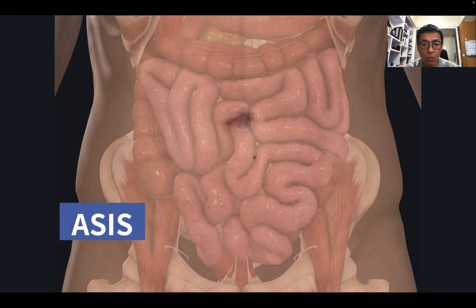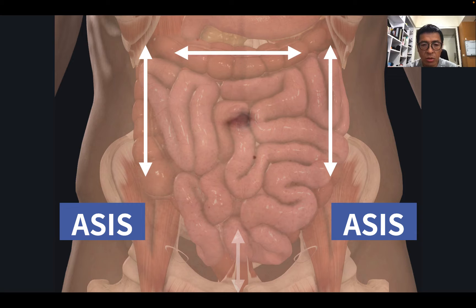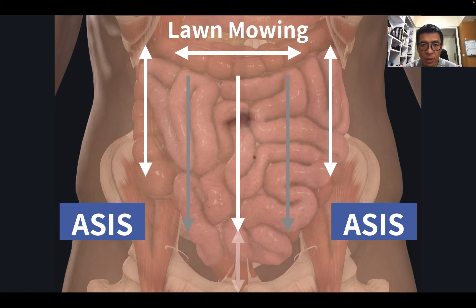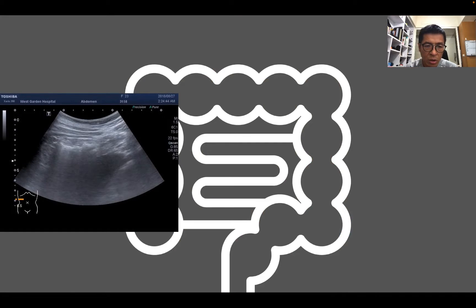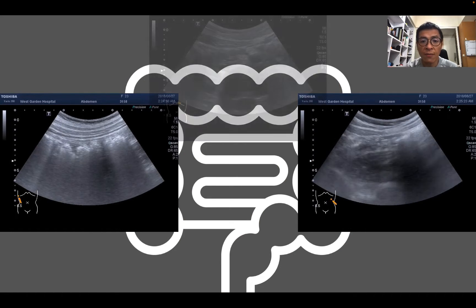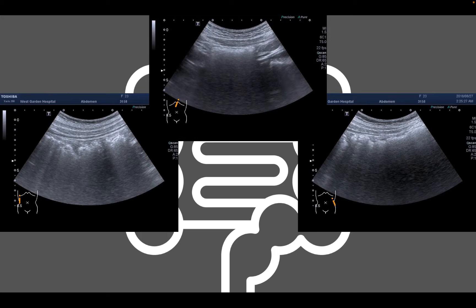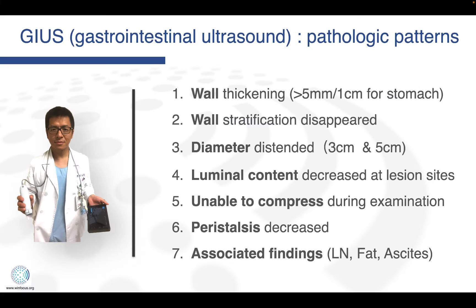Use bone as our landmark — palpate the ASIS, and then scan transversely from ASIS to the costal margin, the same for the descending colon. It is also possible to use the bladder as our window to observe the rectum. Then go to the non-fixed parts: transverse colon, and the rest of the small bowel loops using this maneuver. When you are familiar with the pattern, it is easier to observe the transverse colon based on the haustra.